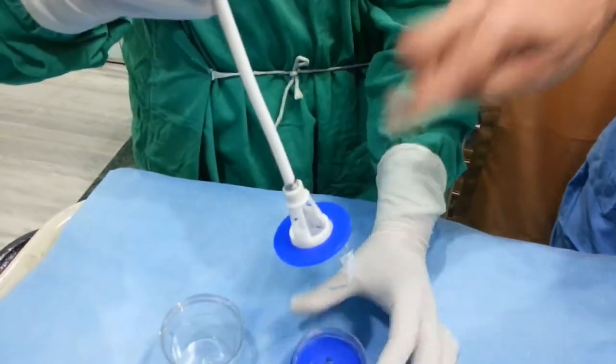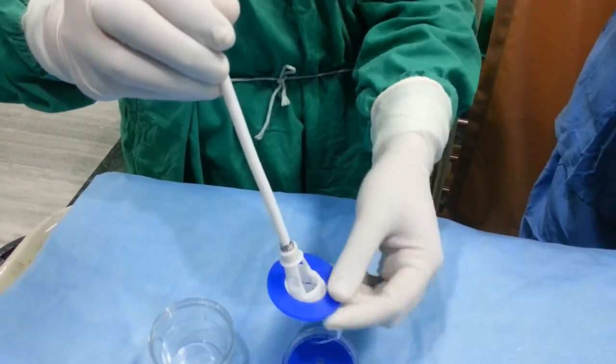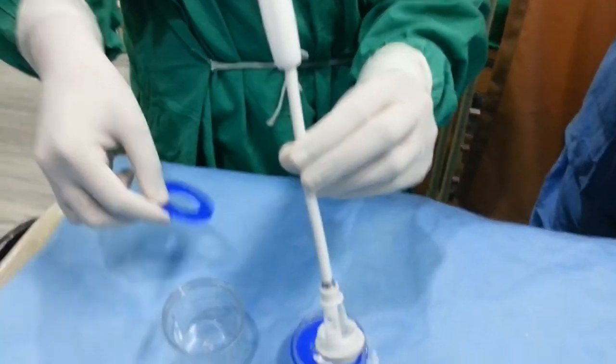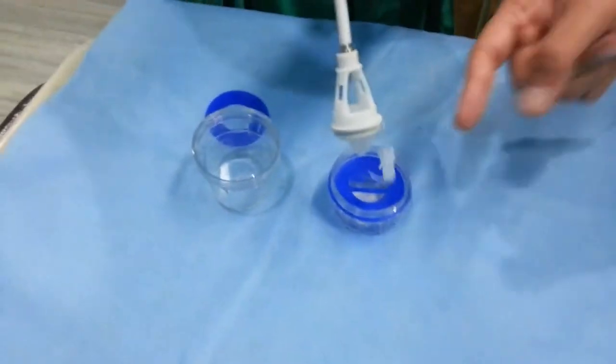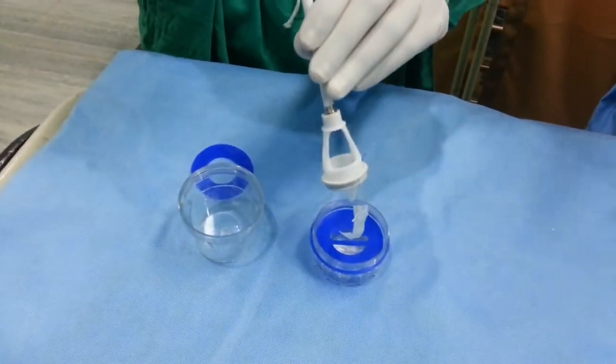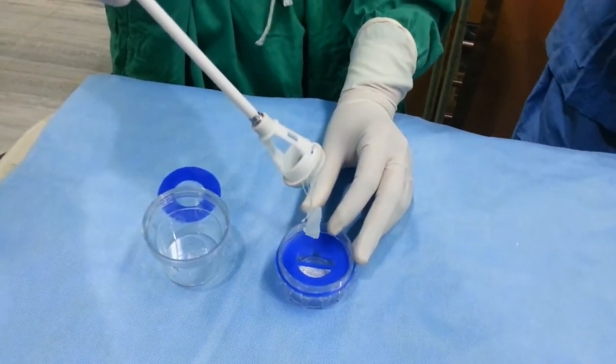And then now she takes the blue ring out, and we are left with a valve and a tag. This tag has to be cut. She cuts this tag and gives this to the surgeon. The surgeon can then implant the valve.